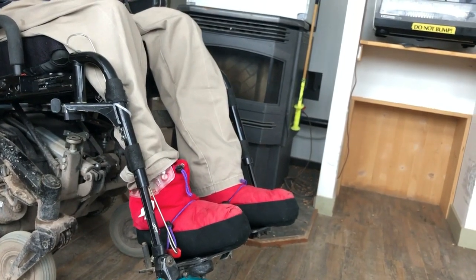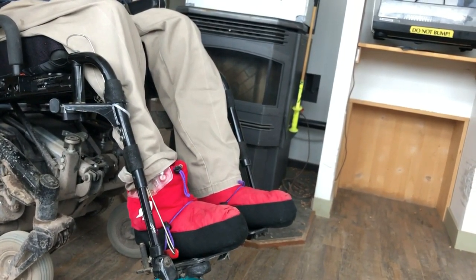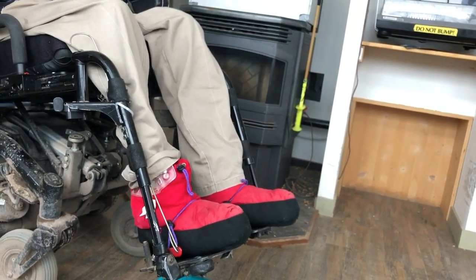But another way you could actuate the valve is go down to your local automotive store and pick up a push-pull cable or a power takeoff cable, I think they're called, and hook the handle up to that somehow. But also, I think with technology today, some techie person out there, I bet they could hook up a servo motor to it, and it would make an electric leg bag emptier.